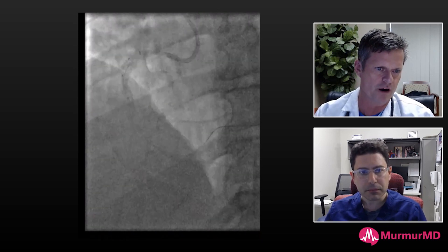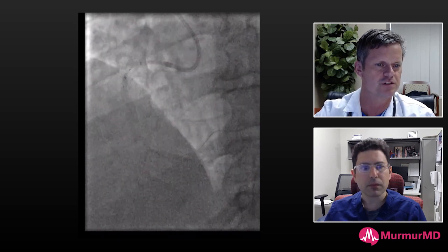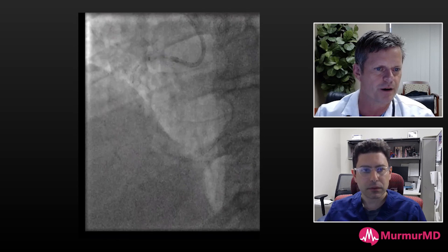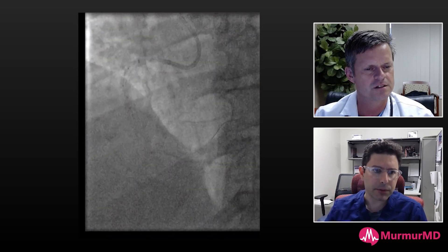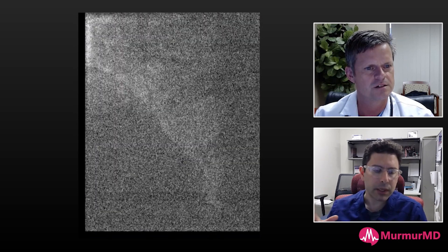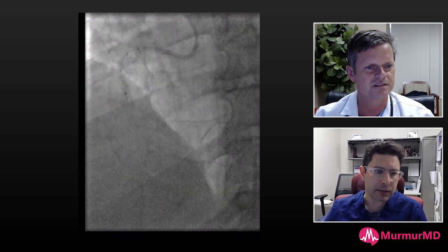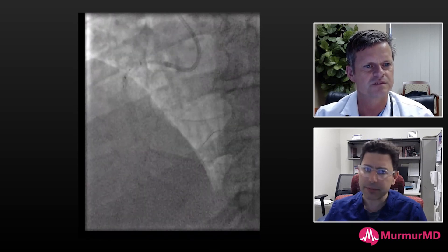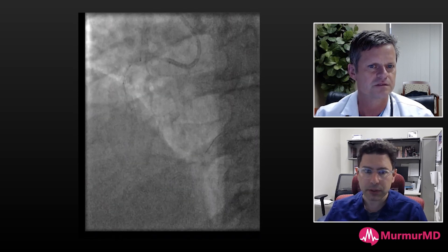You load them one at a time over a wire — put the 8 French up first, then put the 6 French inside as you push them up. If the aorta is tortuous you may face some difficulty, but I usually fluoro the proximal port of the 8 French guideliner and make sure my 6 French guideliner is passing smoothly without any issues. I haven't had any problems doing that, but I could if the anatomy is very tortuous.